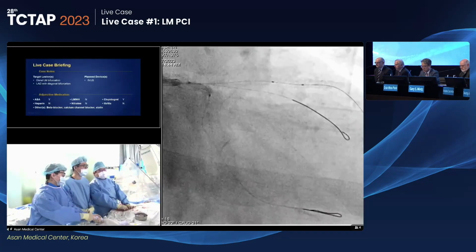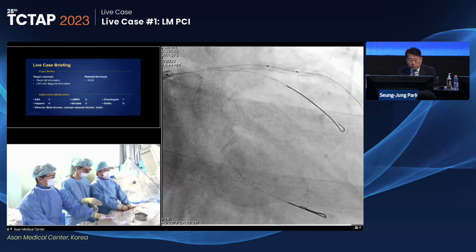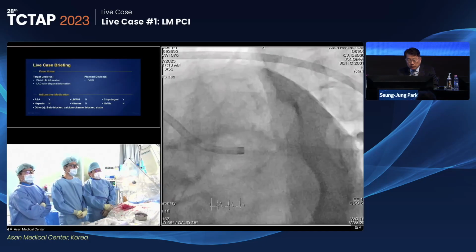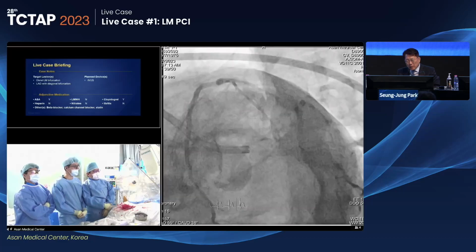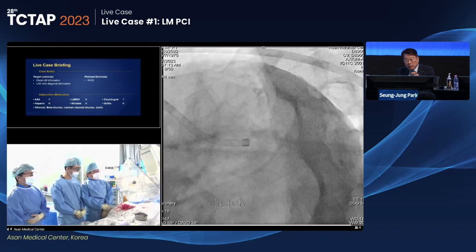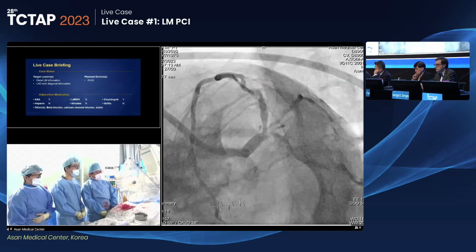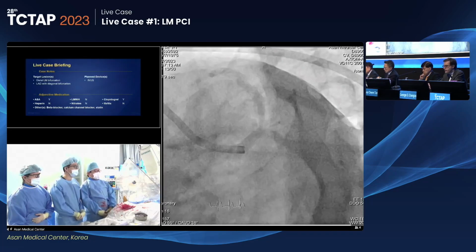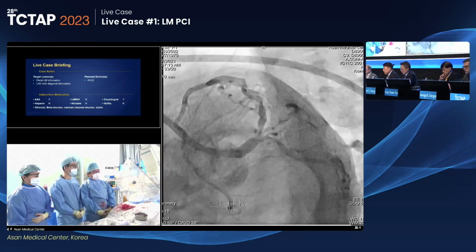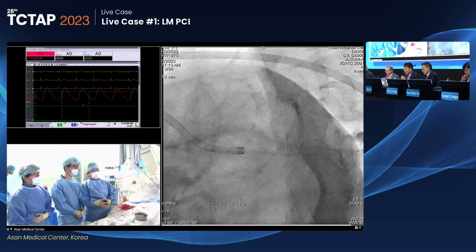Thank you, Professor Lee. Do you have any comments on the patient history and coronary angiogram? So could you show us the first coronary angiogram? As Professor Lee mentioned, the RCA we already treated 3 days ago. So this is the spider view of the patient, very calcified, complex left main trifurcation, including the distal left main bifurcation, high diagonal branch, and circumflex. So how to treat this patient?